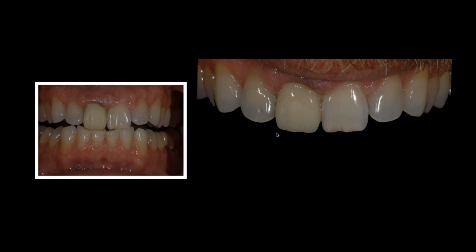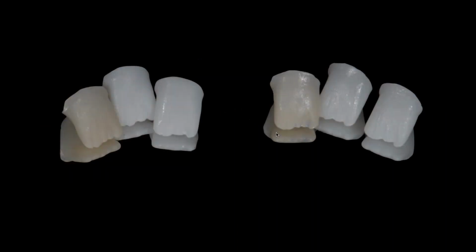So if you look at the number 8 tooth here or the 1-1, and I'm going to make a zirconia core on that. I did this case a long time ago, and I think this was one of the first or second generations of the zirconia. And what was interesting is, at that point, we did have a more translucent material, so I made 3 different copings. One of them was a colored coping, where I actually colorized it. And back then, I'd be honest, the colors were really not that good. Today, they're much, much better.